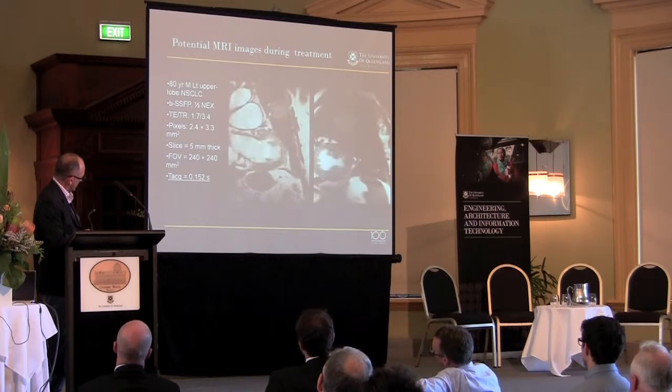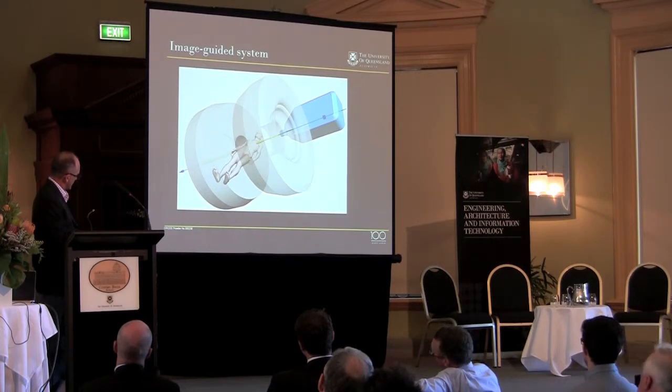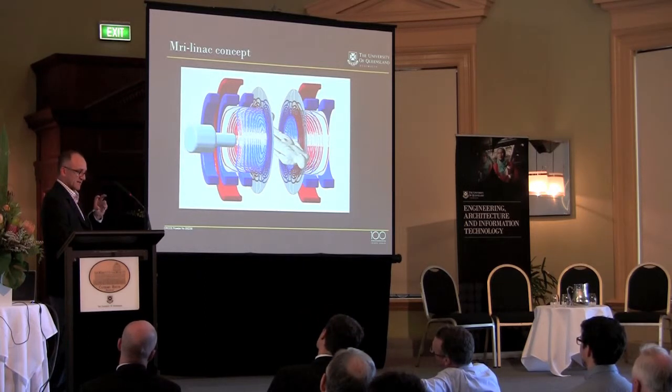And this is another view of a different tumour through the heart. You can see that the motion is quite complex and through plane. It's not linear motion. It's very difficult to predict. There's the tumour there. So our idea is to develop a new sort of magnetic resonance technology where the system is split, the patient lies in the middle, and we have the radiation device here. We have funding to develop some of the technology, and this is the insides of some of it. Superconducting coils, at minus 269 degrees Celsius. Coils that enable spatial localization of the image. And then we need a number of peripheral devices to monitor the well-being of the patient and to feed that back to a radiation therapy device, which is highly magnetic. Integrating those two systems together is a major challenge.